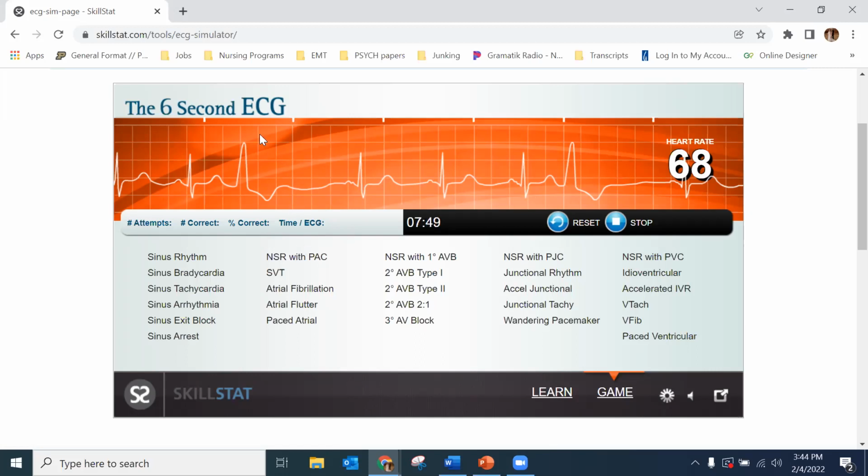All right. So what thing totally stands out here? The wide QRSs. Yeah, super wide QRSs, and there's just two random ones, right? So what do you think this is? Is it NSR with PVC? Yeah, it's PVC. Because again, the rest of my rhythm looks okay, but you have these giant beats that don't make sense. If the whole rhythm was all of these, then that's when you have your idioventricular. Or if you have multiple P waves, like if you remember what that third degree looked like. So that's why these become more and more apparent to you guys.